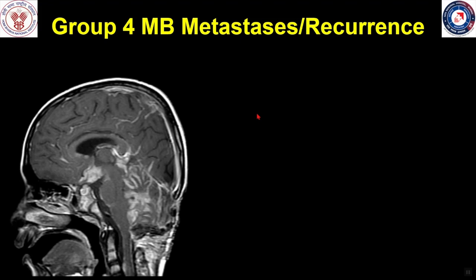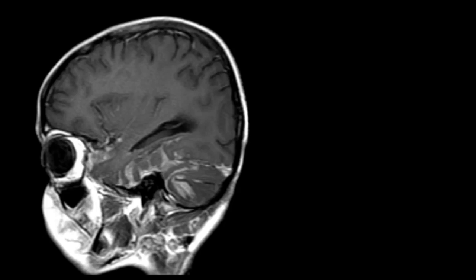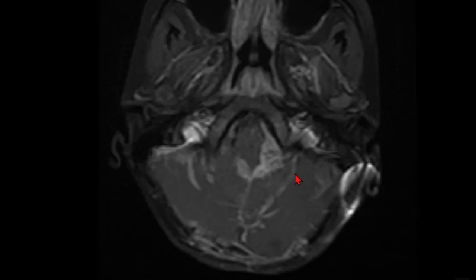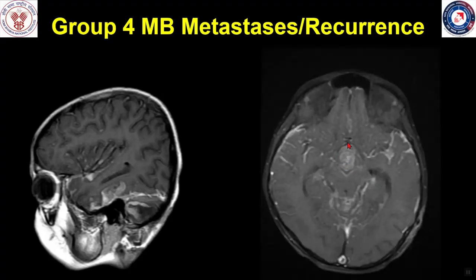This was a child treated for Group 4 medulloblastoma who presented with cerebellar signs — positive Romberg test and inability to perform tandem walking. On post-contrast studies, there is extensive leptomeningeal enhancement involving the cerebellar fissures, the fourth ventricle, pineal region, and the surface of the brain stem. A deposit is also seen in the anterior part of the third ventricle or suprasellar system — a characteristic appearance of Group 4 medulloblastoma metastasis. Leptomeningeal enhancement is also identified in the temporal sulci and extending along the surface of the brain stem.